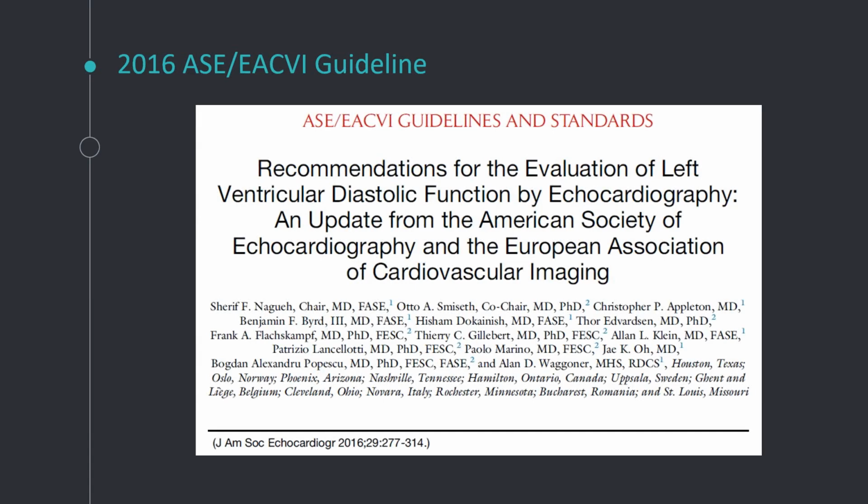Well, let's go to the 2016 ASE and EACVI guideline. There was a 2009 one which talked about a lot of those. And as per the 2016 guideline, they say that it was too complex, too complicated. A lot of readers thought that you have to satisfy every single one of those criteria, when in fact, diastology isn't really dependent on one number, because a lot of those different numbers can depend a lot on extrinsic circumstances, such as preload, heart rate, extrinsic pressure, a lot of valve disease, heart rhythm. A lot of those things can affect your E prime measurement, E wave, A wave, etc.